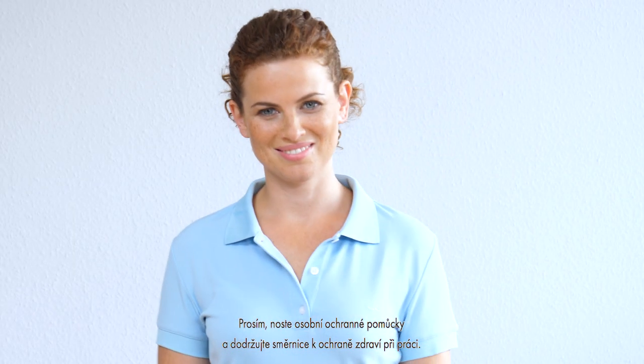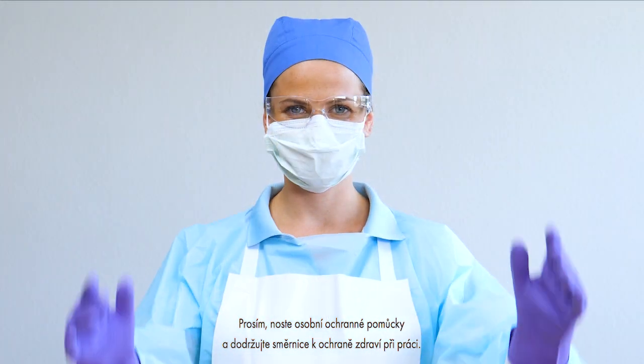Please wear personal protective equipment and observe the occupational safety directives.